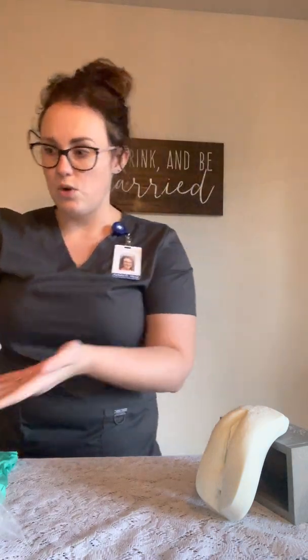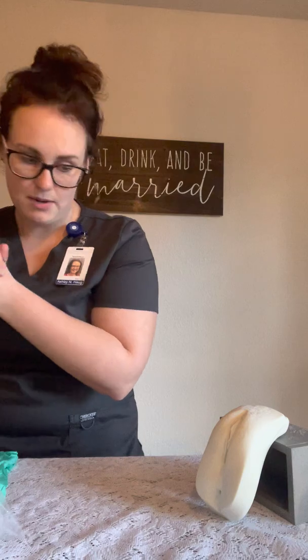So first I'm going to knock on the door, enter the room, wash my hands and introduce myself to my patient. Hi, Miss Jones. Good afternoon. How are you doing? Good. I verified her name and her date of birth, and then I'm going to explain the procedure to her.